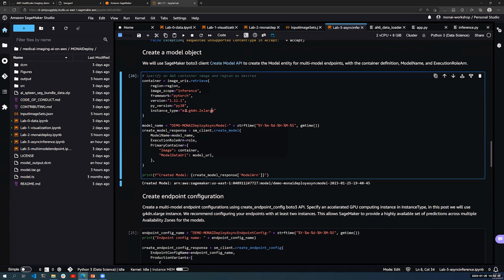You will notice that there is an ML in front of it. That's because this is going to be the same hardware profile as a normal G4DN 2x large instance. But then the ML instance will come with some specific file system, which is already prepared to run machine learning software. So you will find, for instance, Python and PyTorch installed on it, all these kinds of things. You don't have to do it yourself. It's built in that specific image for you.